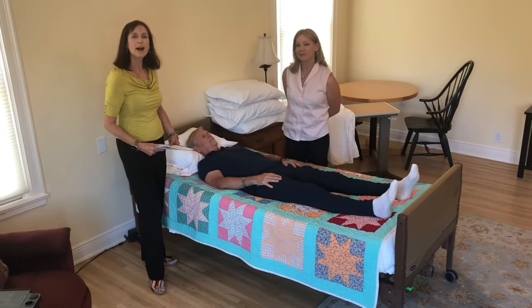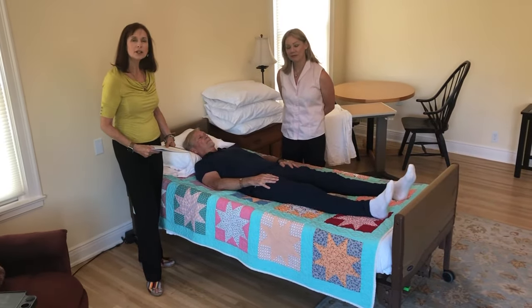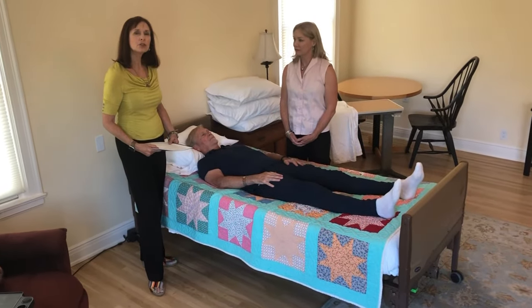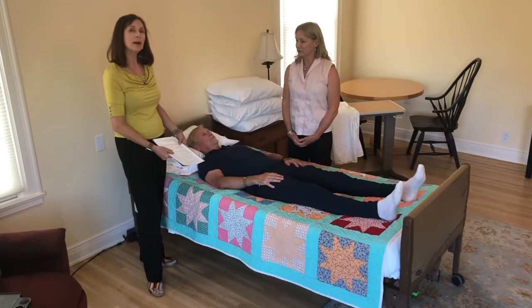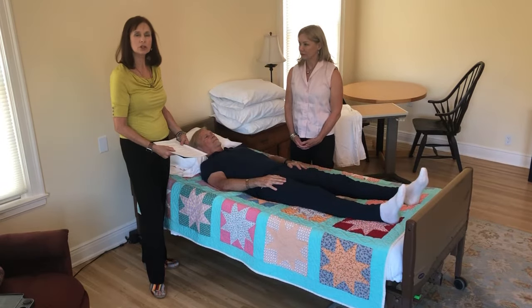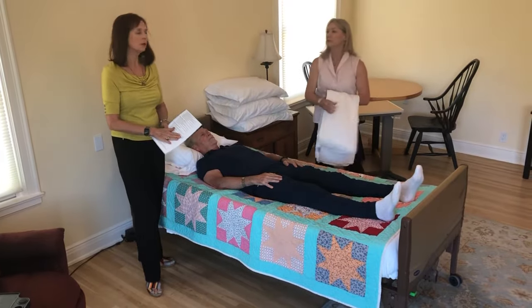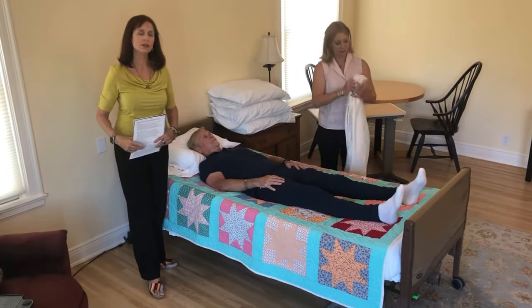Hi, I'm Brenda Cazier. I'm Nancy Hierman. We're two hospice nurses, and we're going to teach you today how to take care of a patient in the bed. Specifically right now, how to put a turn sheet under the patient. I'm going to actually read out of our instructional manual, and Brenda's going to demonstrate the process.